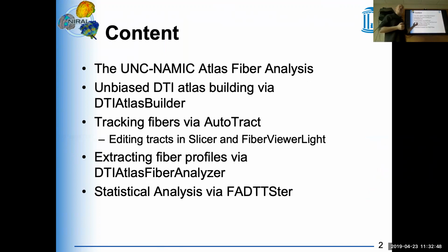There are other alternative fiber analysis methods out there. There's one actually in FreeSurfer. It's called TRACULA. They are just releasing one specifically for infants. They call it TRACULINA. And I'm actually due my reviews. Oh, maybe I shouldn't say that. Anyway, I'm a reviewer for it, and I should send my reviews back in.